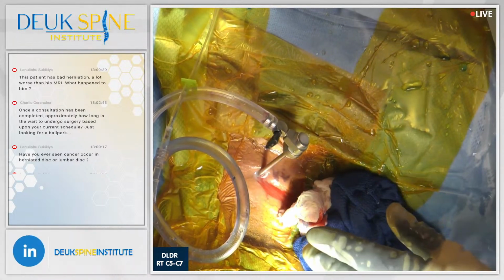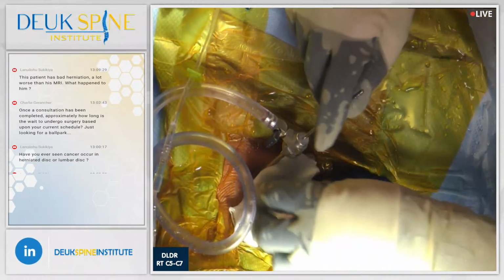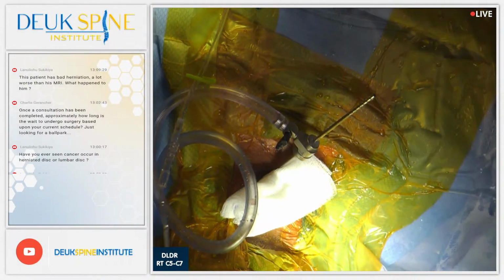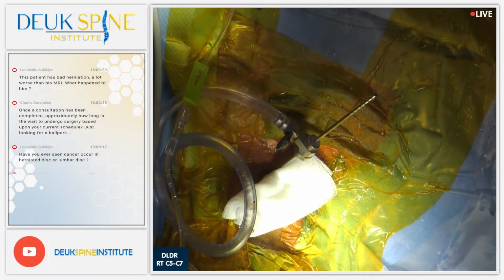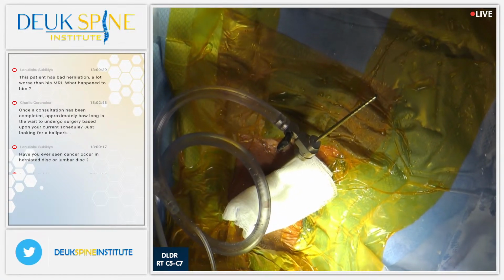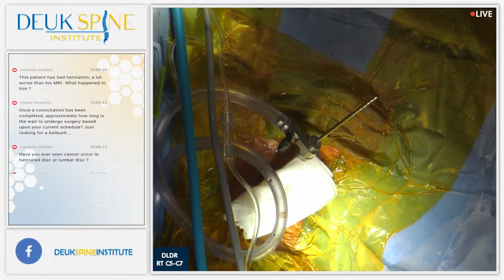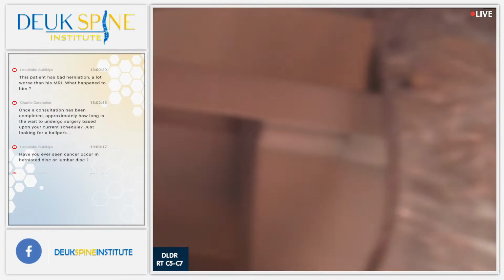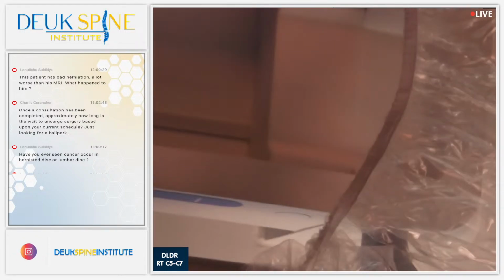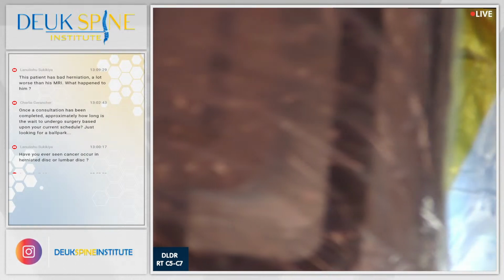Any questions? Yes, we have a question from Lanu once more on YouTube. Asking, the patient has bad herniation, a lot worse than his MRI. What happened to him? Yeah, it's a great question. So first of all, MRI is just a picture in time, right? And certainly whatever damage is done on the MRI could get worse over time since the MRI was done. That's probably what happened. That's what mostly happens.